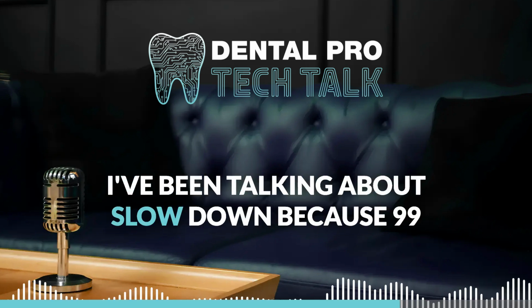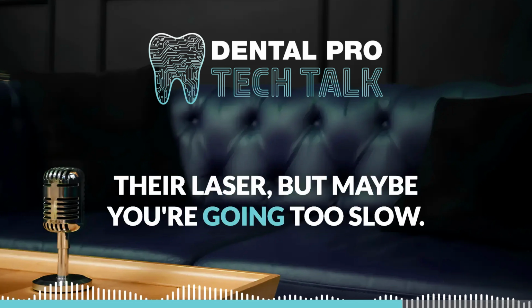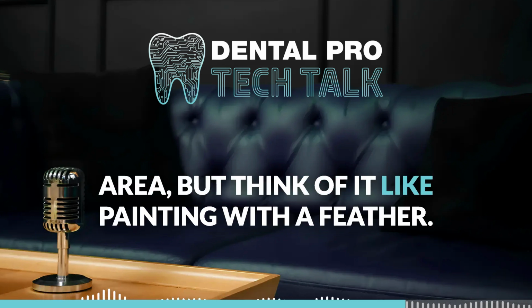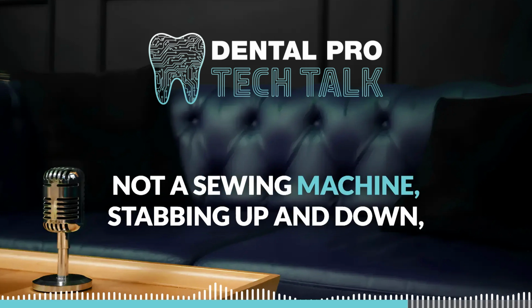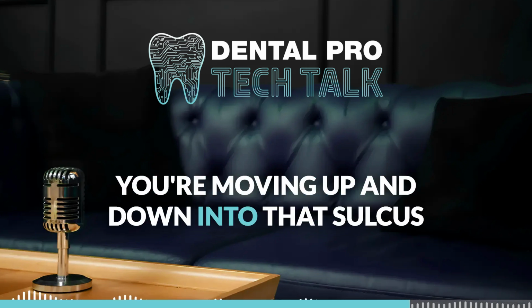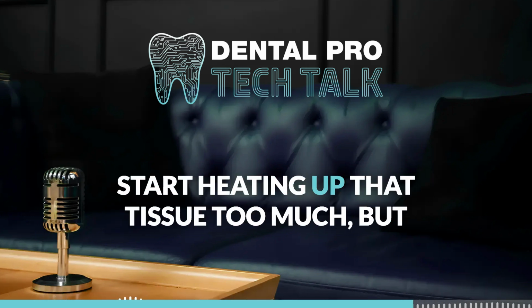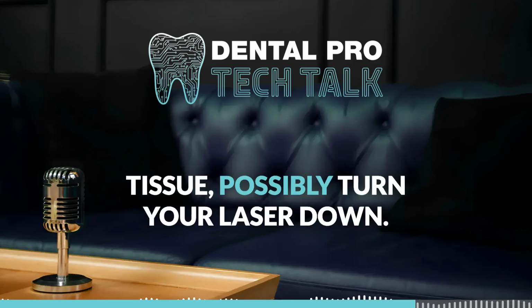It could be that you need to maybe speed up. Here I've been talking about slow down because 99% of the people go too fast with their laser, but maybe you're going too slow. Maybe you need to speed it up a little bit so you're not stopping in each particular area. But think of it like painting with a feather. You're going to be consistent movements, not a sewing machine stabbing up and down, but consistent painting with a feather where you're moving up and down into that sulcus and then moving side to side just very fluently. And that's going to be your best bet to not start heating up that tissue too much. But slow down in most situations, read the tissue, possibly turn your laser down.